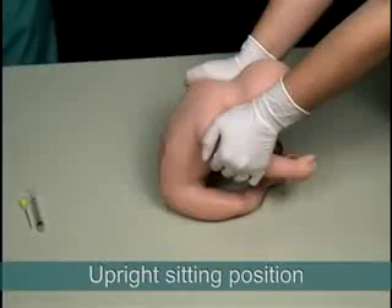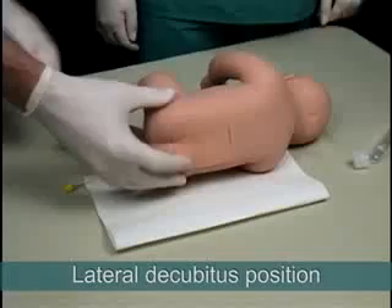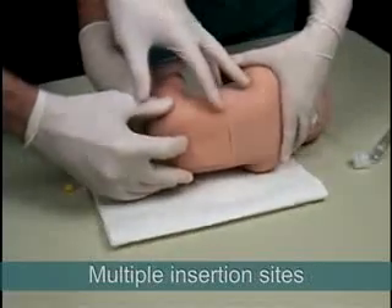This versatile trainer can be placed in an upright sitting position or on its side, and the insertion sites include L3, L4, and L4-L5.